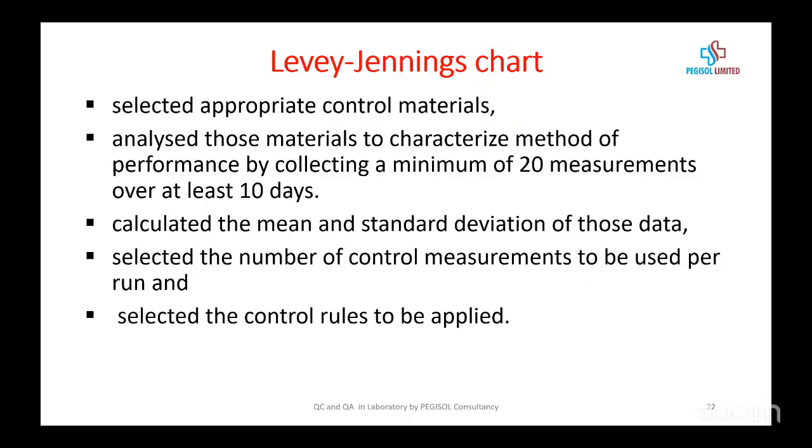Okay, look at this. When plotting a Levey-Jennings chart, you select the appropriate control materials. You analyze those materials and assess the method performance by collecting a minimum of 20 measurements over a minimum of 10 days. Then calculate the mean and standard deviation of the data. You can do that through analysis, you can do it manually, or even with an Excel sheet. Select the number of control measures to be used per run and select the controls to be applied.